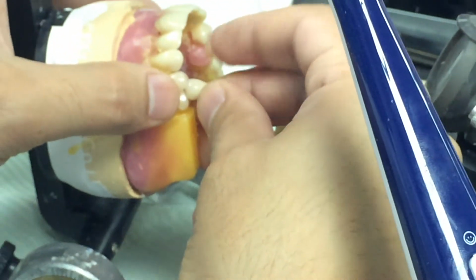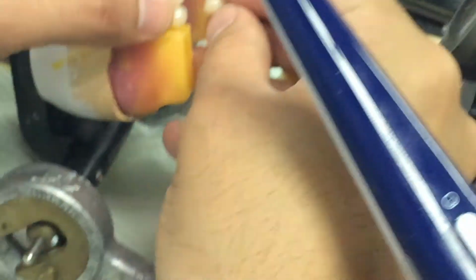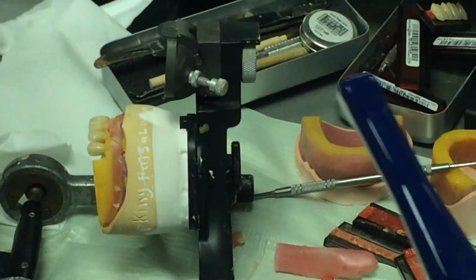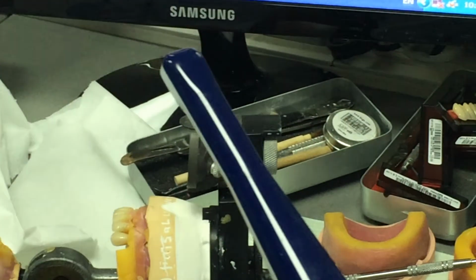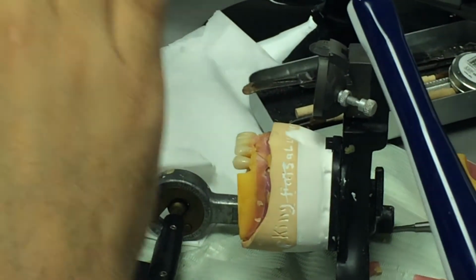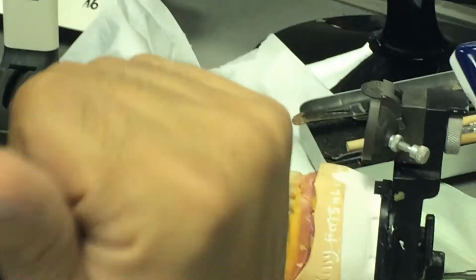After that, here will be the second one. So the lower posterior teeth are all in occlusion. So you have to take your time with the upper to make it perfect, and then the lower is going to be very easy for you. We have to start with the upper posterior teeth before we proceed to the lower. I prefer that you start with one side, I mean posterior upper right, let's say, and then posterior lower right, from the same side. Then you go to the other side. Is it clear for you guys?